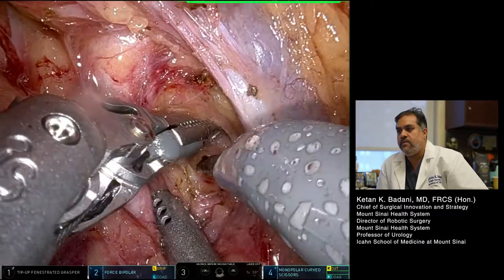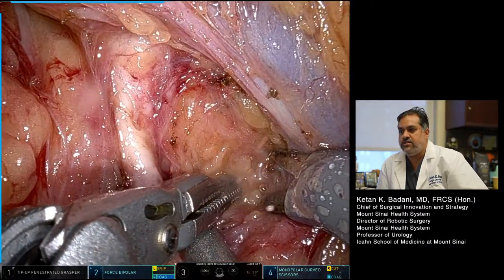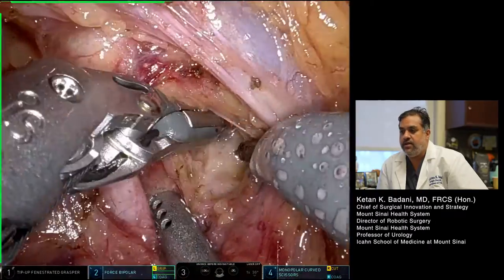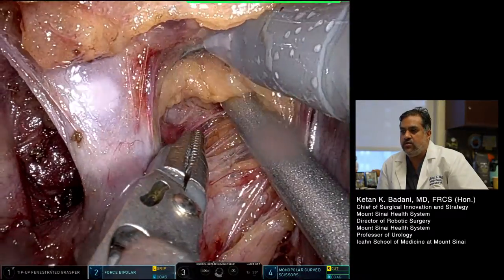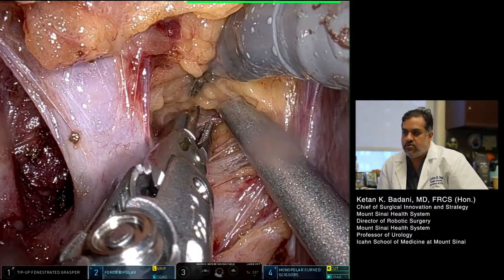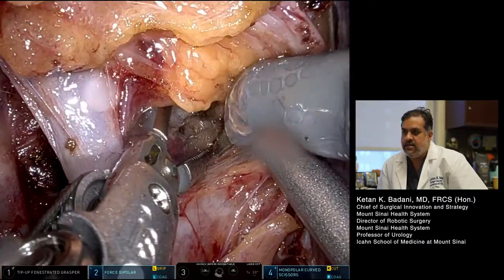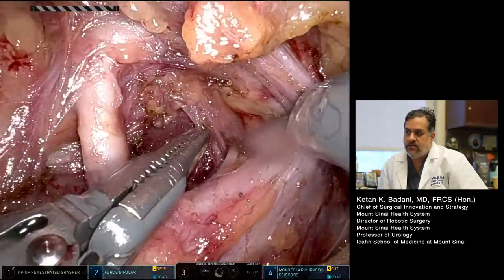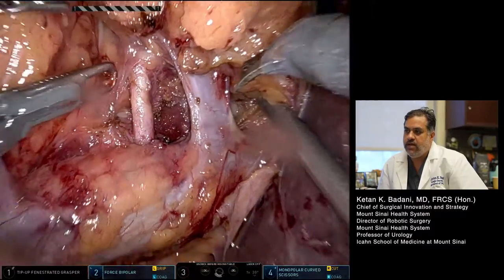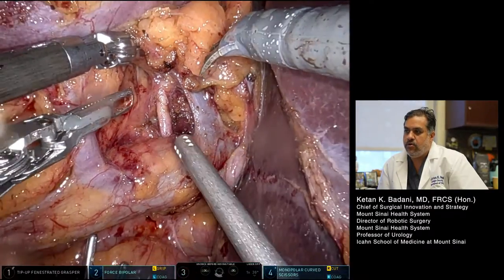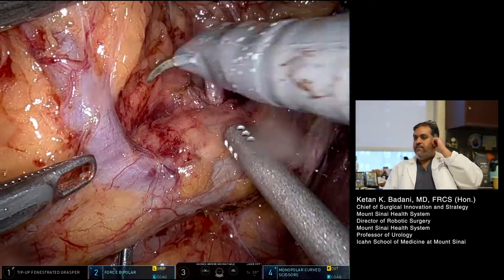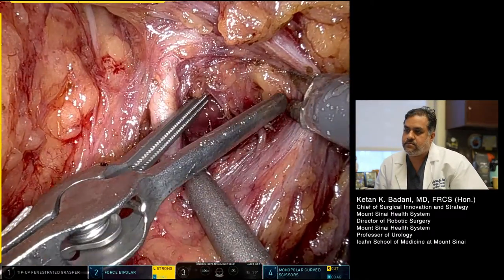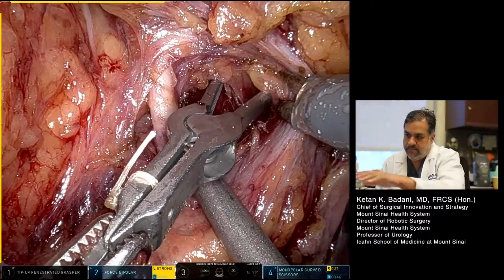I'm dissecting to find the smaller branch of this renal artery. Because it's an endophytic tumor that goes posteriorly, I want full ischemic control of this kidney. All of this prior surgical scarring around the hilum is not pleasant, but as you work through it using the force bipolar and monopolar scissors, it's tedious but well worth taking the time. Now we've got the lower pole branch, lower pole vein, and the renal artery all dissected out. You see the bulldog clamps at the bottom of the screen pre-placed.